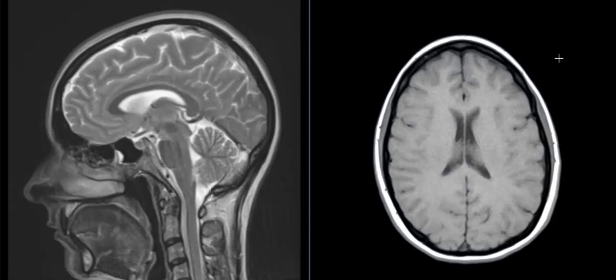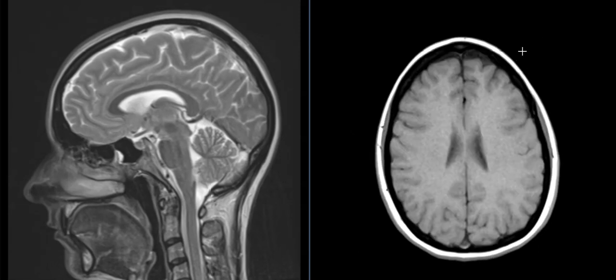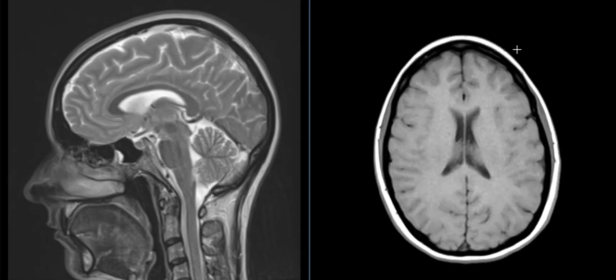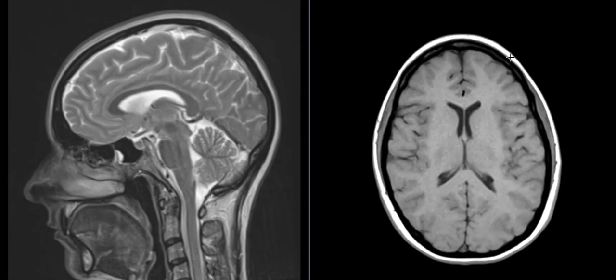Hello, this is Dr. Gay from First Sick MRI, and this is a patient who has normal-sized ventricles. I'm showing this to contrast the next patient who has abnormal ventricles, but this is what they should look like.